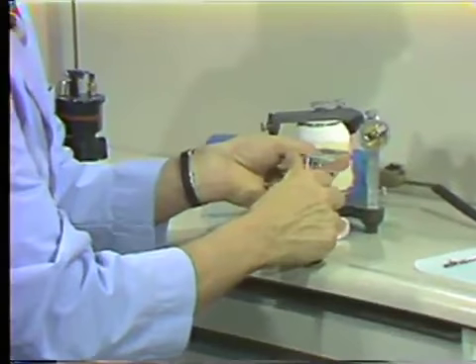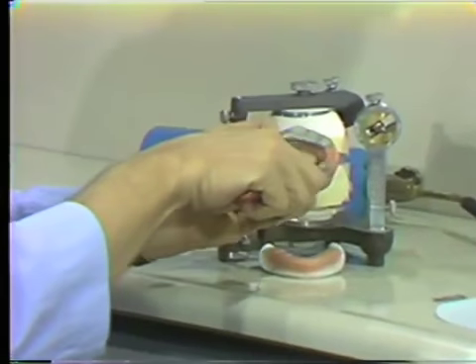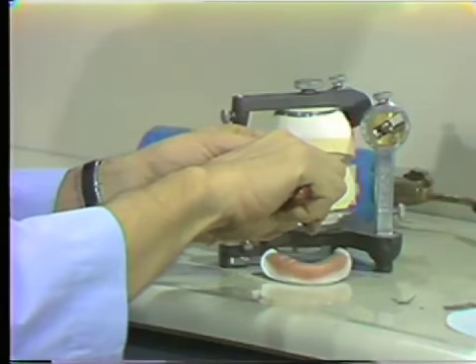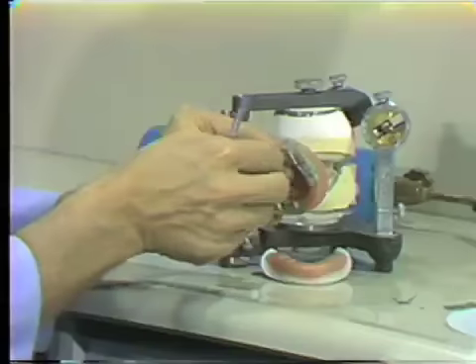Because this wax is soft, it is wise perhaps to double check by returning to the patient once again, just making sure that in the cutting of the wax we didn't pull it in any dimension.